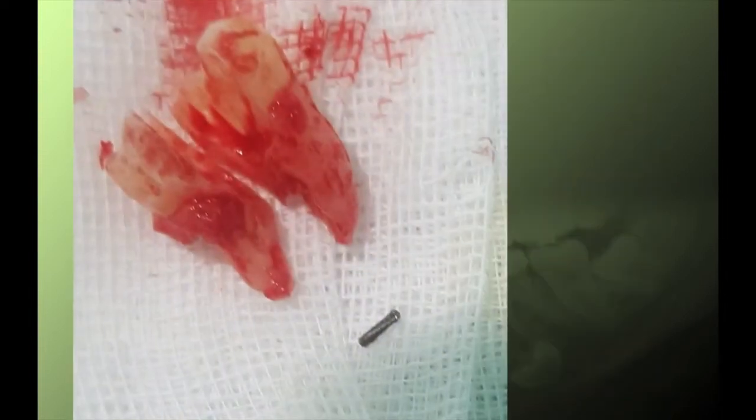Be reminded, however, that disengagement of the carbide bur, particularly at its weakest point, can happen. Now understanding how this happens will greatly prevent it, but always be prepared and focus on your work.